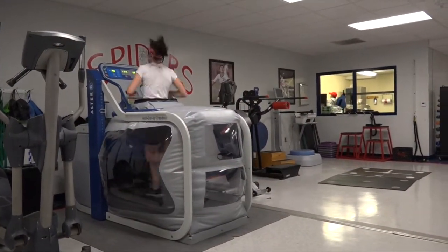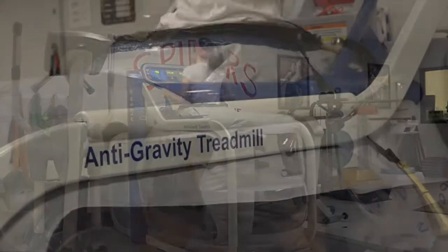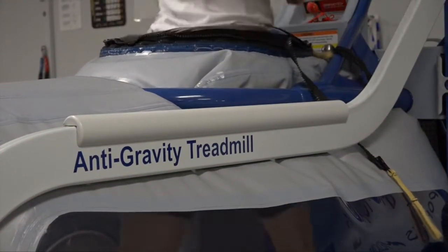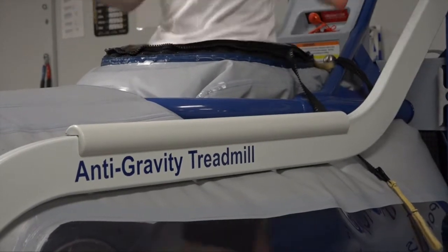The Alter-G obviously allows us to run, allows our athletes to get in and run at varying levels of impact to their bodies. That motion, biomechanically, is so important to what we do. So we look at it as much more than something we'll use when athletes get injured — it's something we are using and will continue to use to prevent injuries.